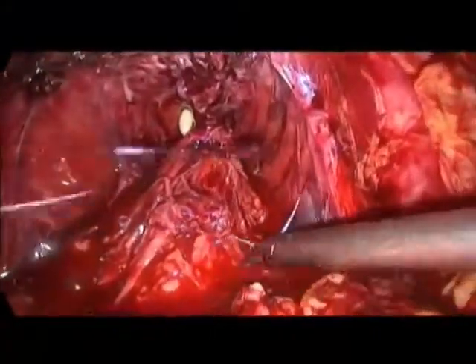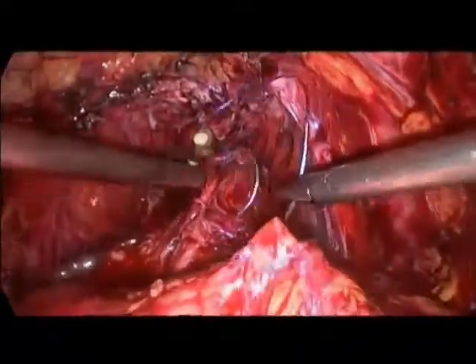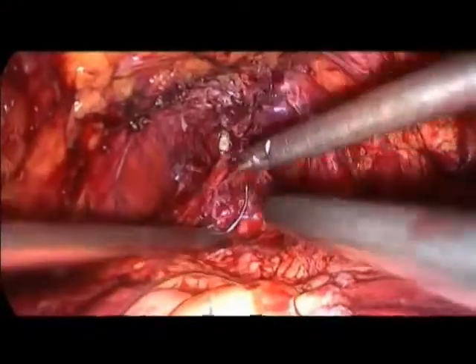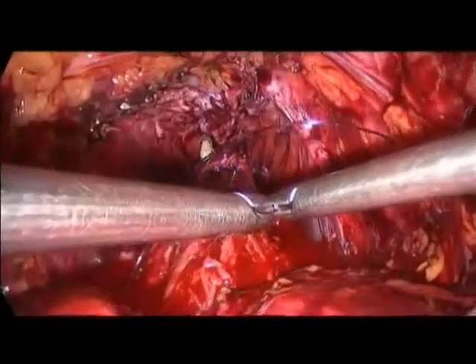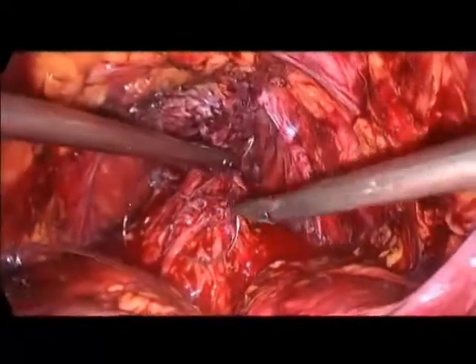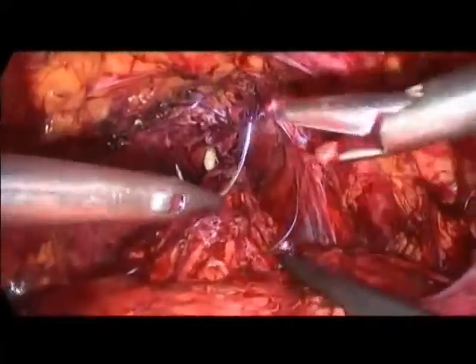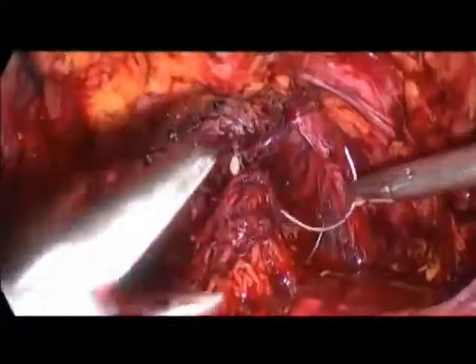Okay, but if the frozen section comes back positive, what will you do? Well, I would extend my lateral excision on the concerned level of the bundle, but you know how many studies have shown that these frozen sections are finally negative. What's the point in getting a frozen section if it will not change the attitude? Well, I didn't ask for them to change my attitude, but I think Vito wants to know the specimen status earlier than we usually know.